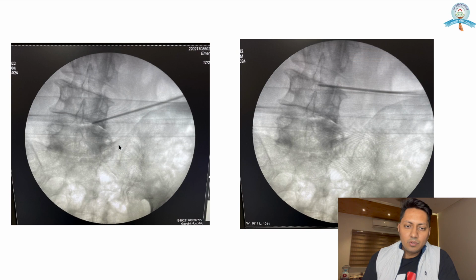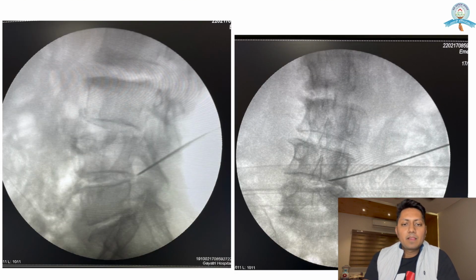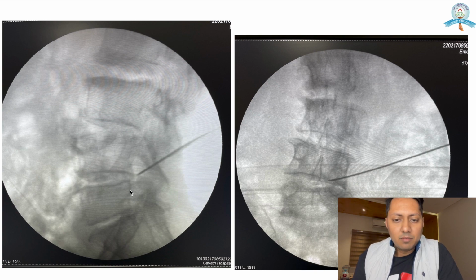Due to the high iliac crest, my trajectory was going above the iliac crest and reaching just above the pedicle at the L4-5 level. At the L3-4 level, I had used the same incision, and I have drawn a line that was going above the pedicle. Due to the scoliosis, our line diagrams are not classical as described in textbooks, but this will work in our case. This is how I had inserted my needle.